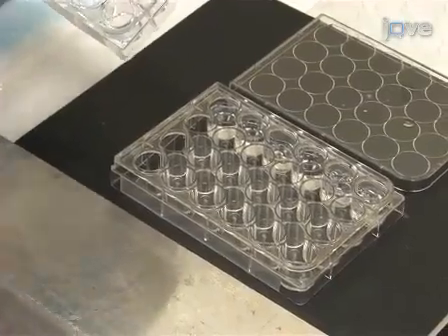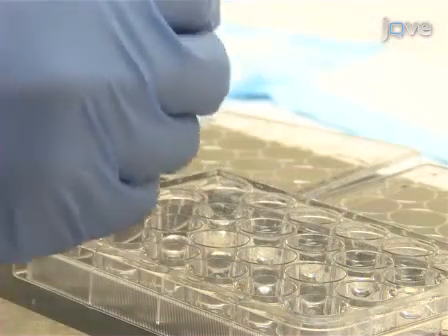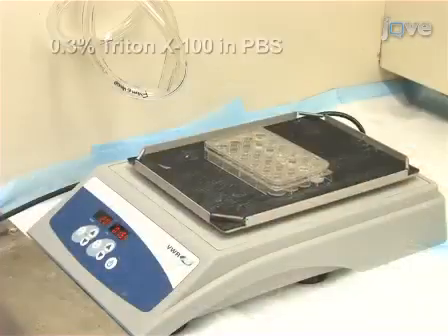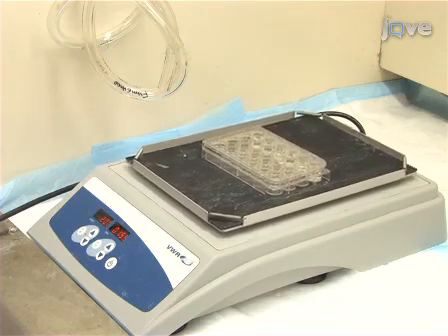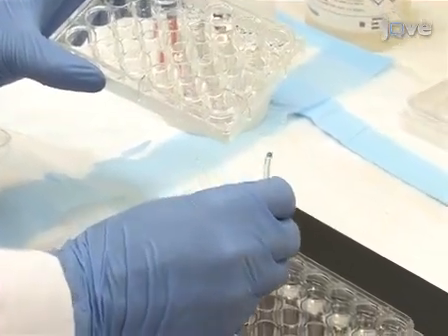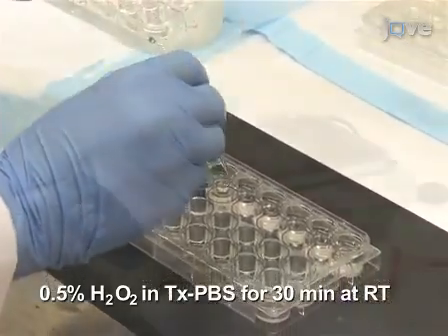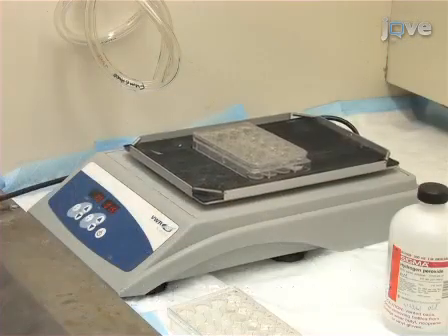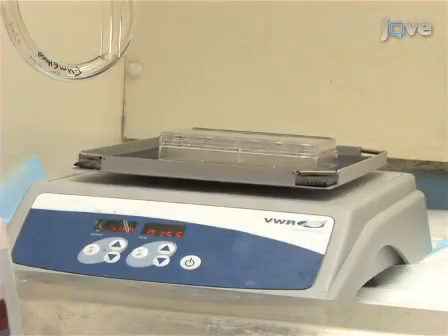Treat each free-floating section with 88% formic acid for 15 minutes. The sections will appear to shrivel. Then transfer each section to a plate and wash 3 times with Triton X PBS for 5 minutes with gentle shaking. Attenuate the endogenous activity with 0.5% hydrogen peroxide in Triton X PBS for 30 minutes at room temperature with gentle shaking. Then wash the sections 3 times with Triton X PBS for 10 minutes under gentle shaking.